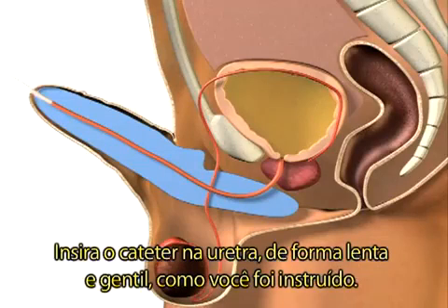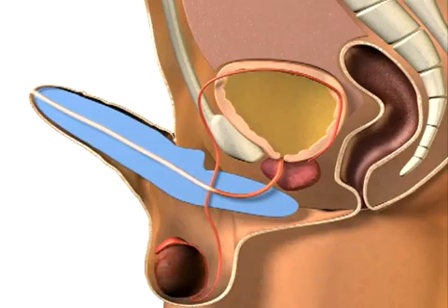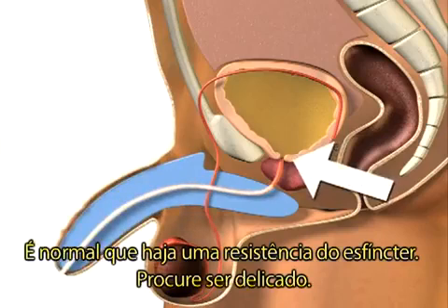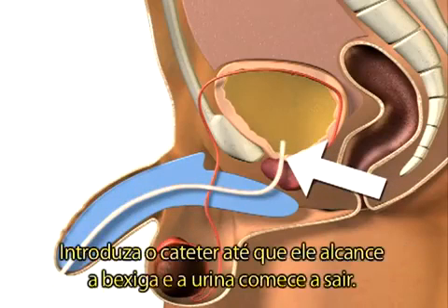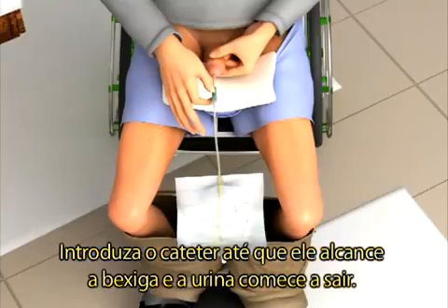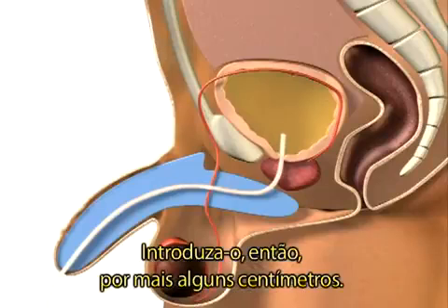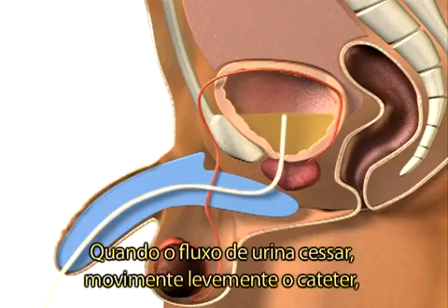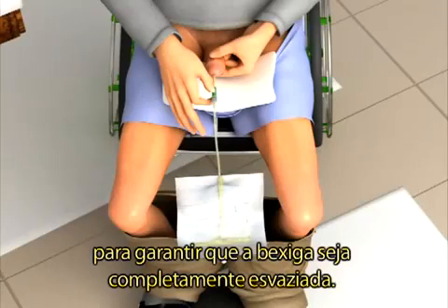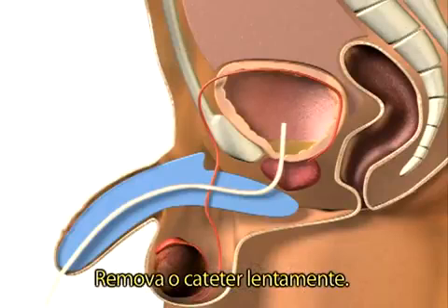Slowly and gently insert the catheter into your urethra as you have been instructed. It is normal that you feel resistance from the sphincter, so be gentle. Continue to insert the catheter until it reaches your bladder and the urine starts to flow. Then continue for a few centimeters further. When the flow stops, move a little and straighten yourself up to make sure that the bladder is completely empty. Then slowly remove the catheter.